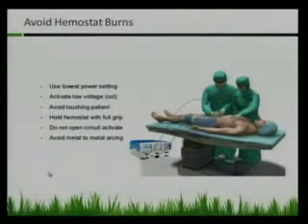This slide is relevant for us. So this is really the one thing that I want everyone to take home. When you grab a hemostat and you get a bleeder, what does everyone do? What setting on your pencil do you use to coagulate that bleeder? Right. And you really should use cut.